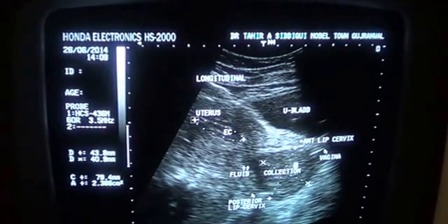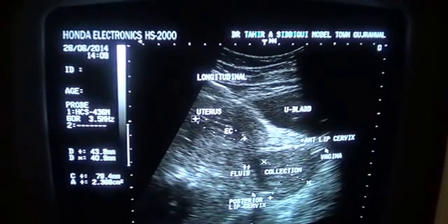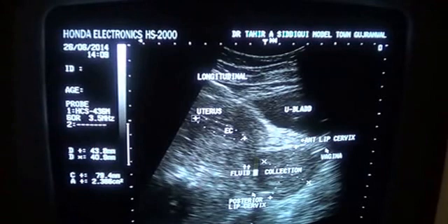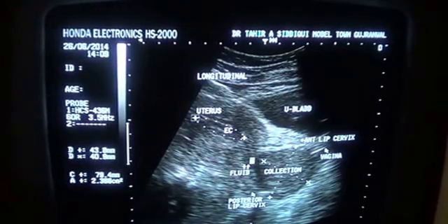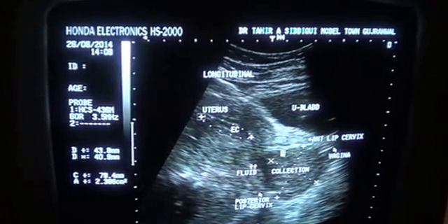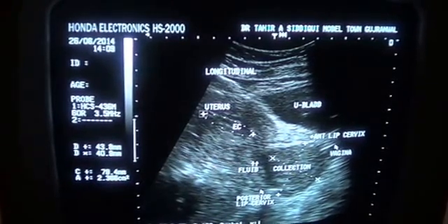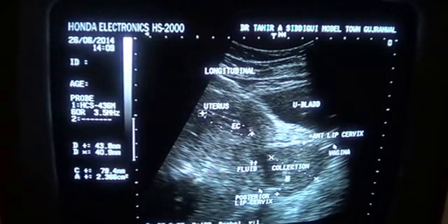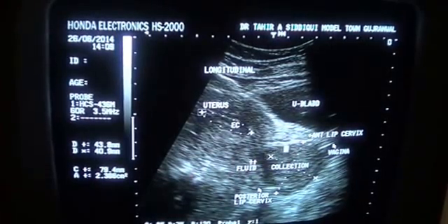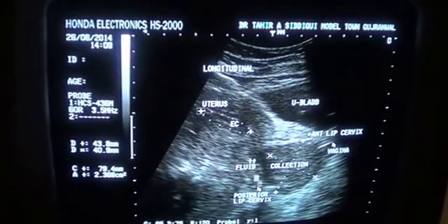Most probably this is the bleed, and it is being confined at its lateral margin by the vagina. This is the vagina, and at its medial end it is being confined by the internal os. So between the internal os and the vagina we see collection of echo-filled fluid. It can be nothing but bleed, collection of bleed with small amount of fluid, and this bleed or collection is elevating the anterior lip, whereas depressing the posterior lip of the cervix.